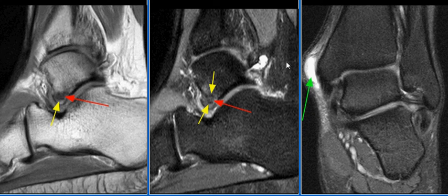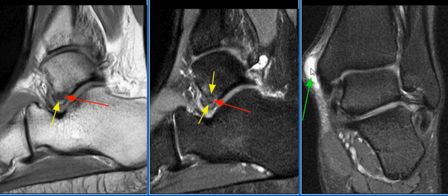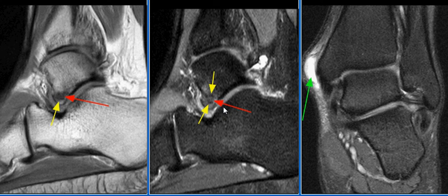There is mild scarring of the calcaneofibular ligament. Overlying the medial malleolus, there is a thick-walled fluid-filled adventitial bursa consistent with bursitis, with adjacent soft tissue edema. MR findings are consistent with a snowboarder's fracture and medial malleolus bursitis.